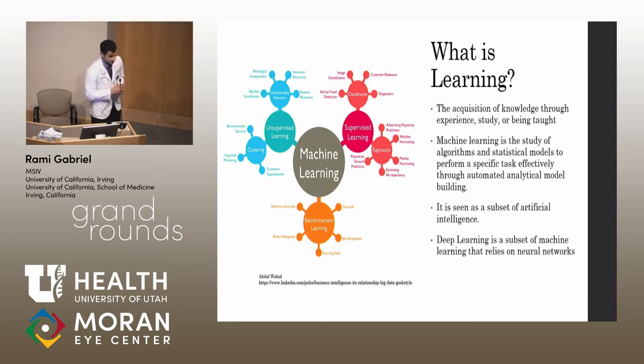And then you have supervised learning. That's where you give it data that has an answer, and so it learns from that data, and then it learns to choose better. You have two different types now. We're going to be focusing on supervised learning for the majority. There's classification, and that's different categories. And there's regression, and that's when you have more linear kind of data, so age, cost, things like that. The bottom one is actually how I first got involved in machine learning. It's reinforcement learning. That's mainly for games and more real-world kinds of applications.